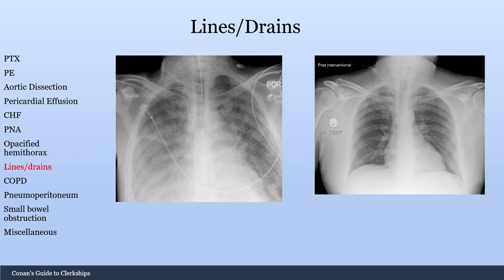Now let's look at some lines and drains. After placing an endotracheal tube, NG tube, or central line, you always get a chest X-ray to confirm placement. Here you can see this line in the trachea — this is an endotracheal tube in somebody who was recently intubated.